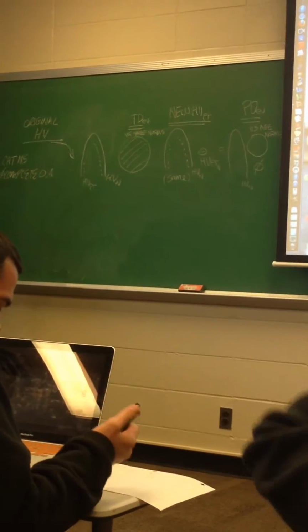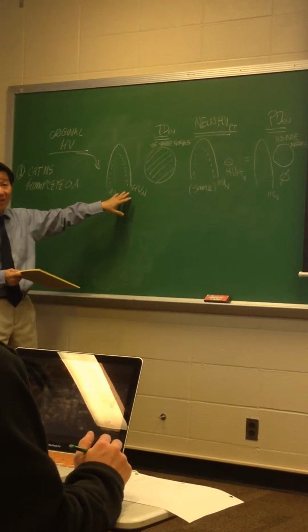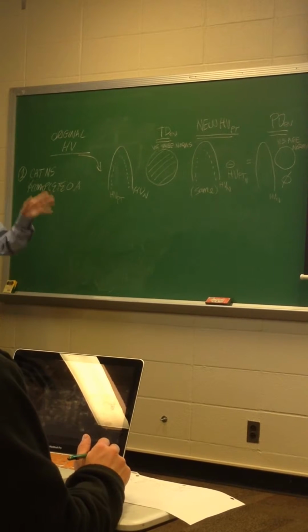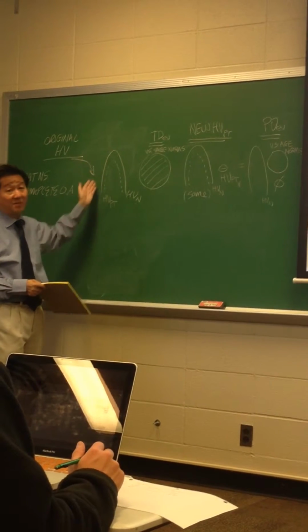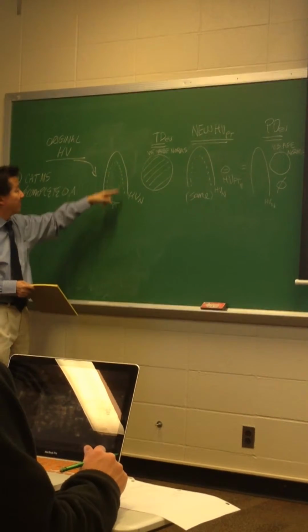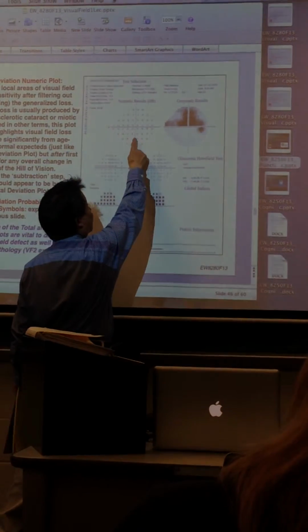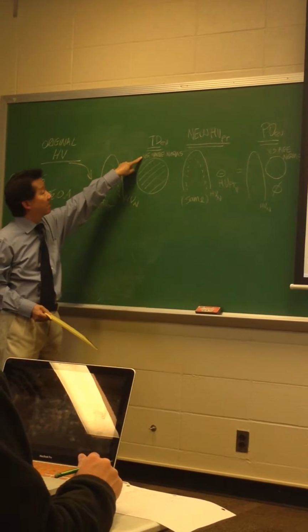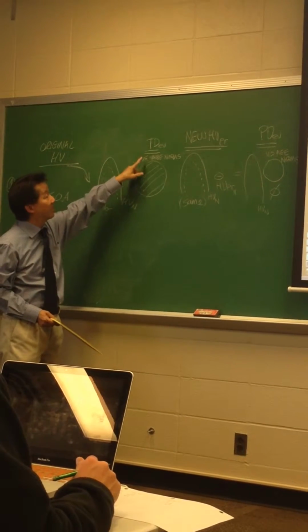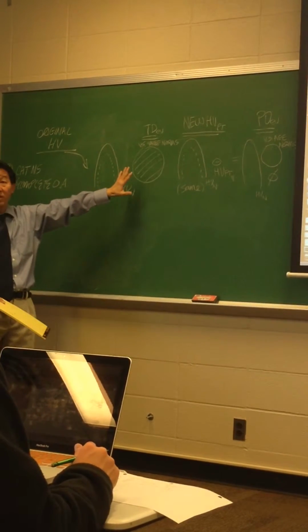So okay. You've got this solid line, which is your age-matched norm hill of vision. Whatever age you are, 25, 40, 80, you're going to have stats for, this is what I'm comparing the field to. This is the patient's actual hill of vision, calculated from these raw scores here, the numeric raw scores, the decibel values. Then there's just this comparison of norms. It's just versus age, and that's how you get the total deviation. And you'll get dark. You'll get loss. It's worse than the age-matched norm. Dark is bad.